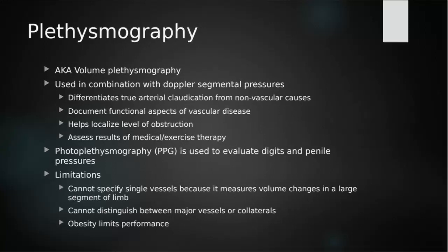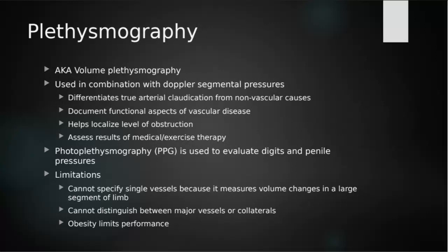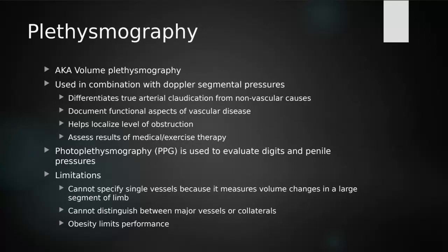It also cannot distinguish major vessels from collaterals. That's that same concept. You have multiple vessels happening in a certain level. We can't determine which one we're really talking about. And of course, obesity is going to limit the performance and the accuracy of this.